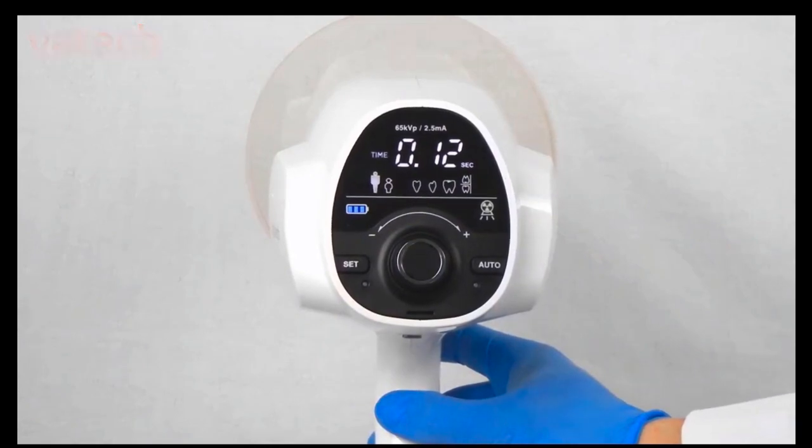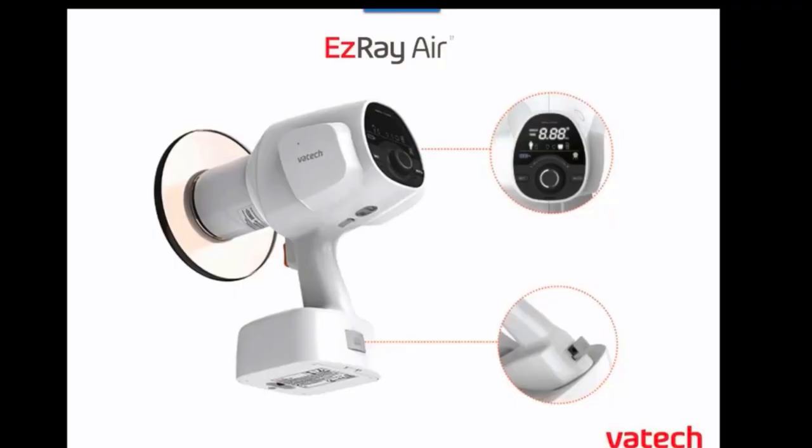That was a quick overview of using the easy ray air and using that jog panel or dial and the digital readout at the back of the device. If you have any questions on that we will be taking those after our session today. Very simple to use handheld x-ray.